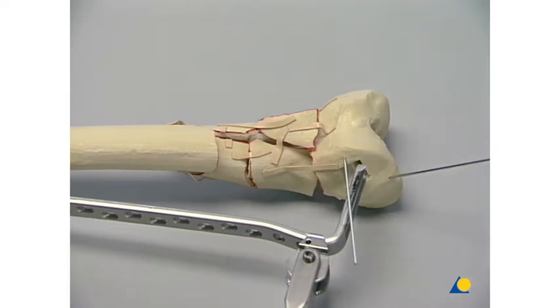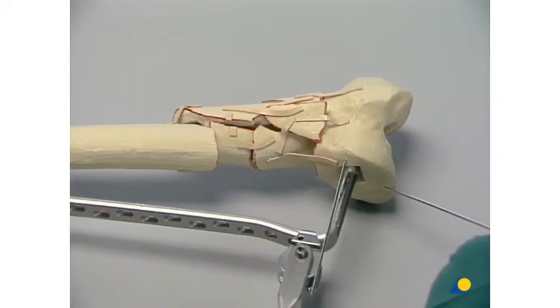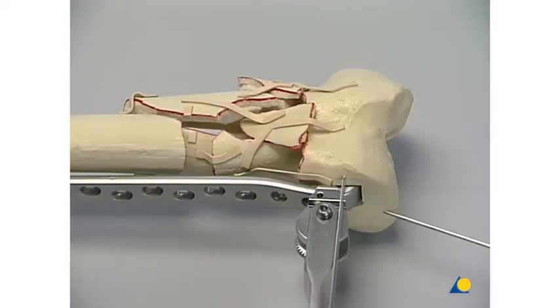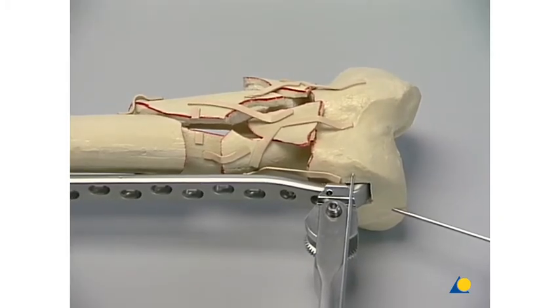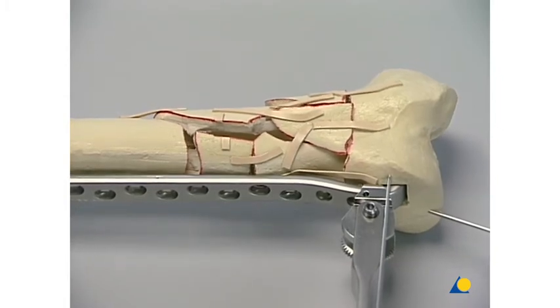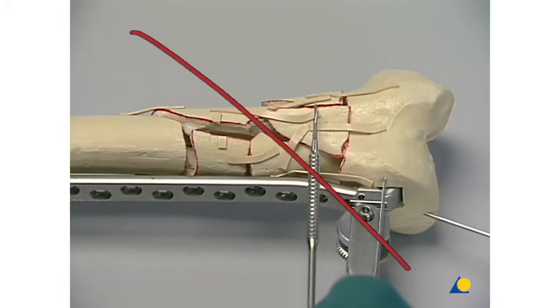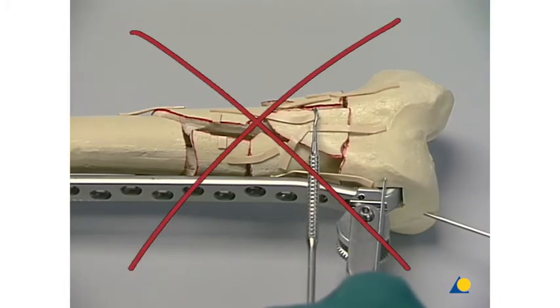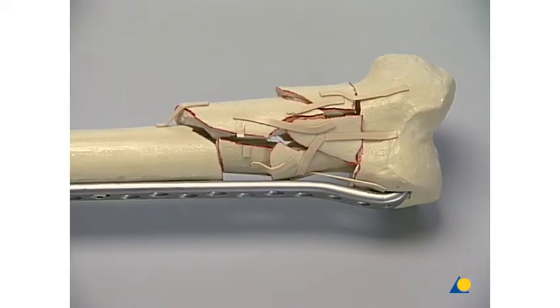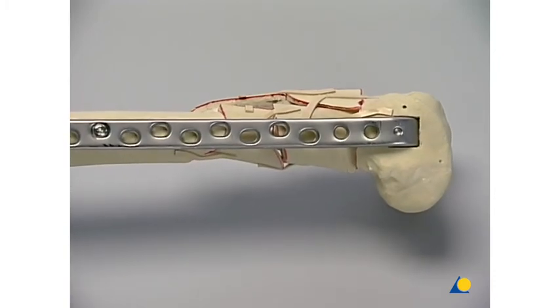The 'bring the piano to the chair' technique is now applied. The distal main fragment is aligned with the blade by abducting the lower leg. A joystick can also be used. The blade of the condylar plate is then pressed into the bone manually. The correct axial alignment of the femur and the partial reduction of the fragments within the comminution zone are then achieved by distraction and soft tissue traction. Traction is created either manually with the femur distractor or using a fracture table. The comminuted fragments must not be exposed; it is neither necessary nor wise to finally reduce the fragments with a dental hook. The fracture has been correctly reduced in both the frontal and sagittal planes. The vascularity of the comminuted fragments has only been marginally damaged by the surgical procedure. A rapid bridging of the comminution zone with callus can be expected.